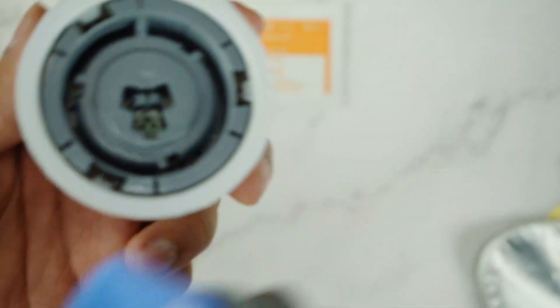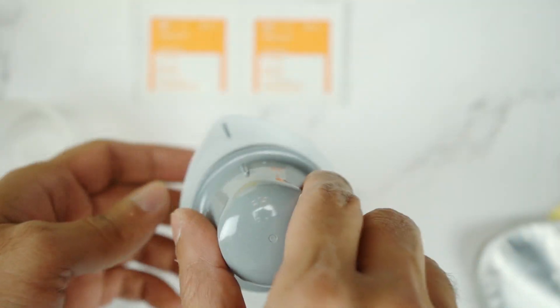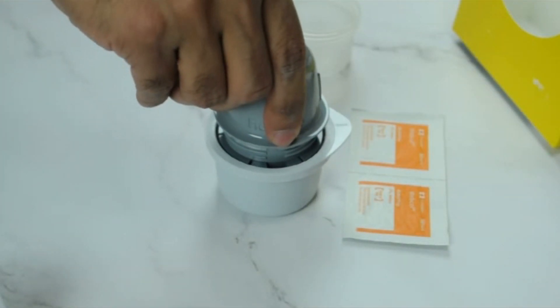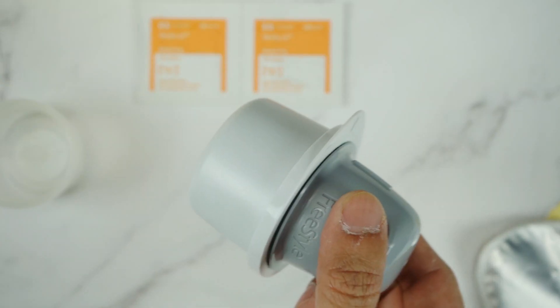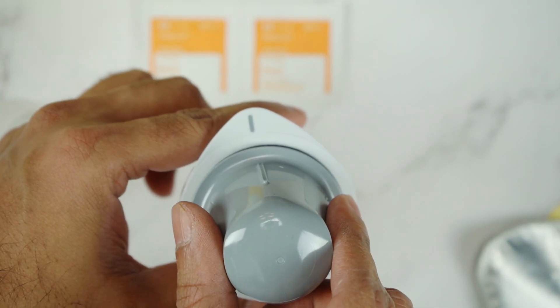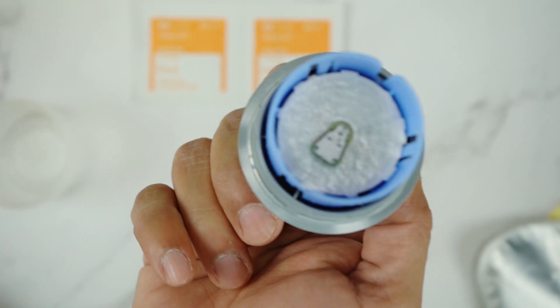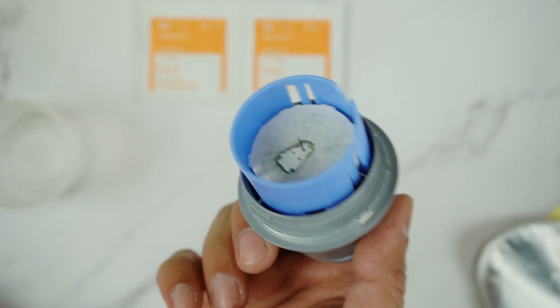The groove means it can go only in one direction, so you have to align this groove right here like this, and then you press it hard until it clicks. Once you hear it click, you know that the sensor is attached. As you can see, the sensor is now attached and it is ready to be inserted.